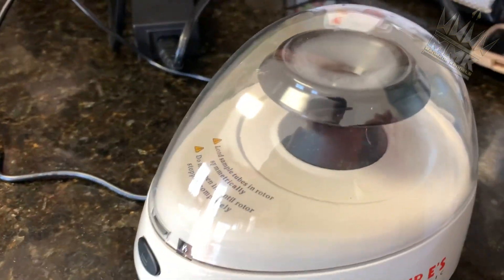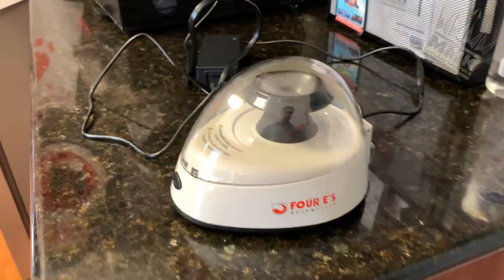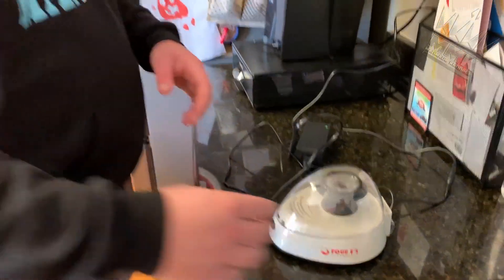I want to spin this down for one to two minutes until we get a nice serum. Alright guys, so that's spinning it down at the moment. We'll take a little break here and be right back. We're back — two minutes have passed. Nick's going to open it up.